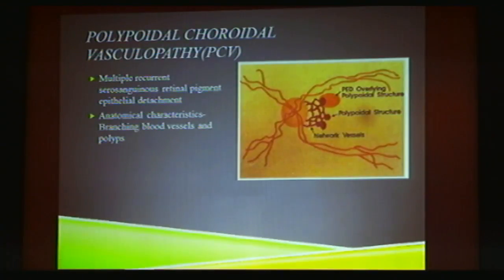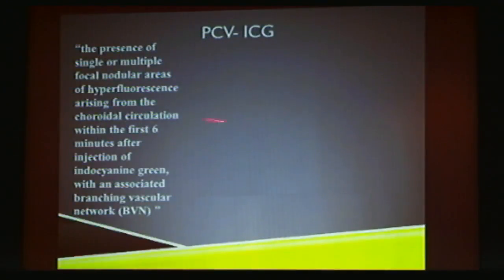But having said that, I must congratulate Dr. Yannuzzi, because it was not with ICG that he proposed the classification and the system of idiopathic polypoidal choroidal vasculopathy. It was based on fluorescein angiography and his astute observation. He wrote his classic paper on IPCV.